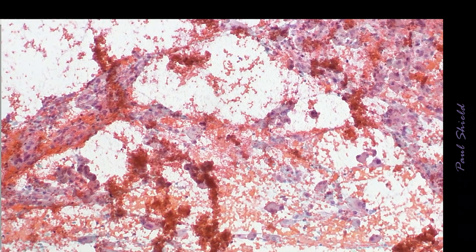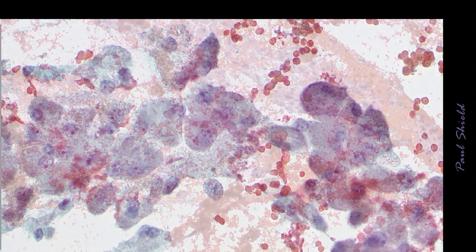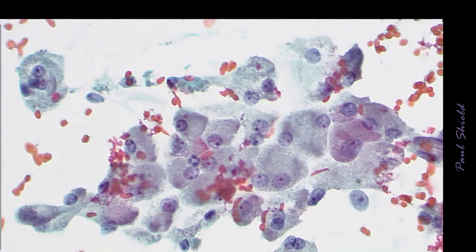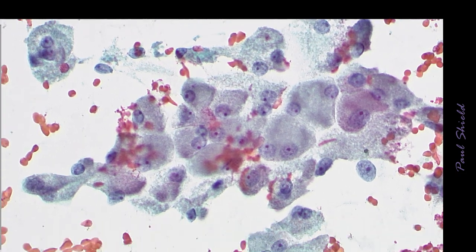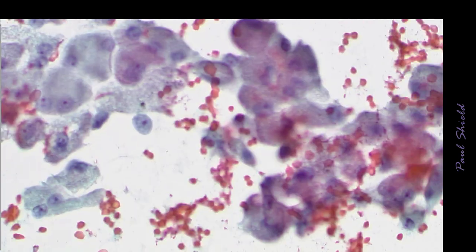You can see spread throughout this and amongst all the clot, there's actually a lot of these cells, and there's really no follicular cells, really not much colloid, just high power. You can see the granules quite well on the ones on the right, and the nuclei. They're showing minimal anisokaryosis, but quite pale chromatin.